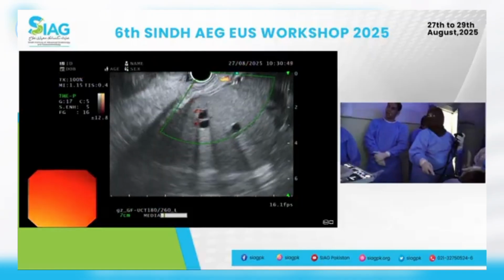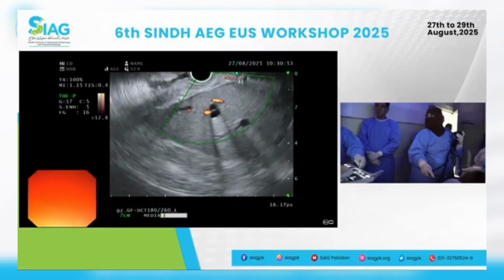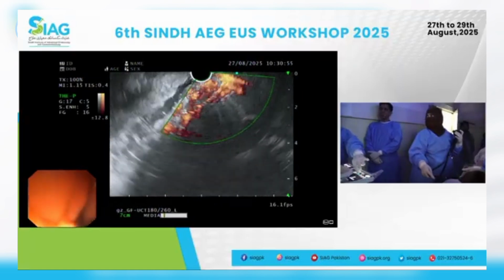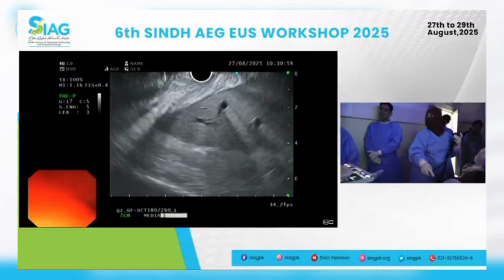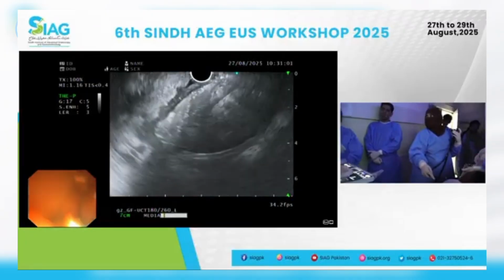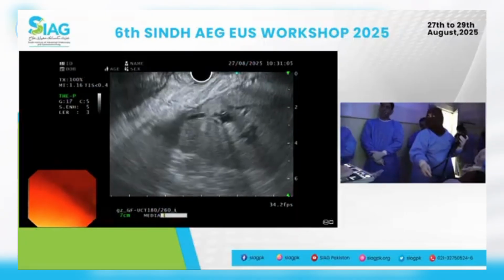Thank you. Good, yes, please. So the intrahepatic ducts are still dilated, which is not a surprise. I think the ERCP was a bit recent. Minimal pneumobilia, which is in keeping with the presence of the biliary stent. Good, okay. The aorta now?